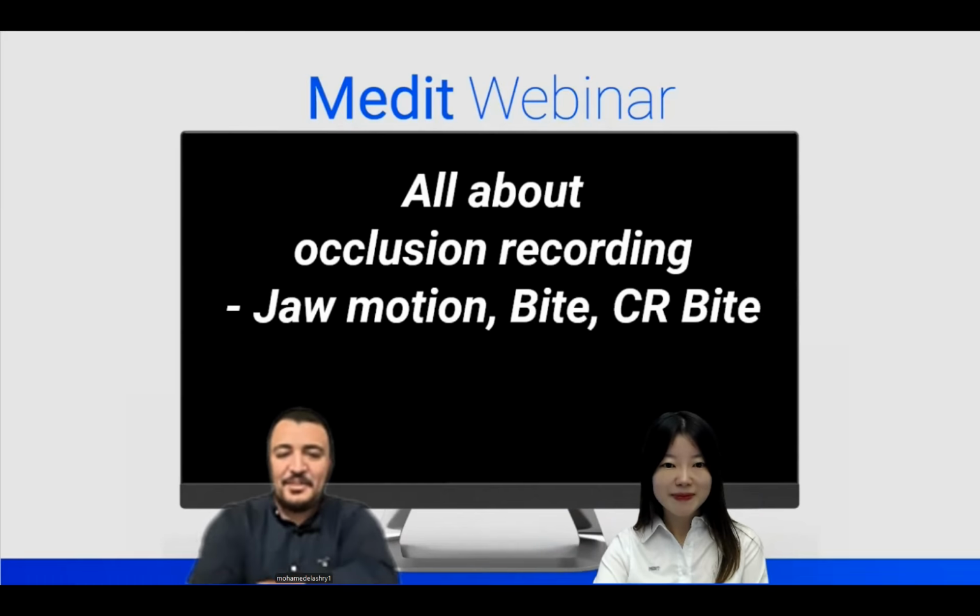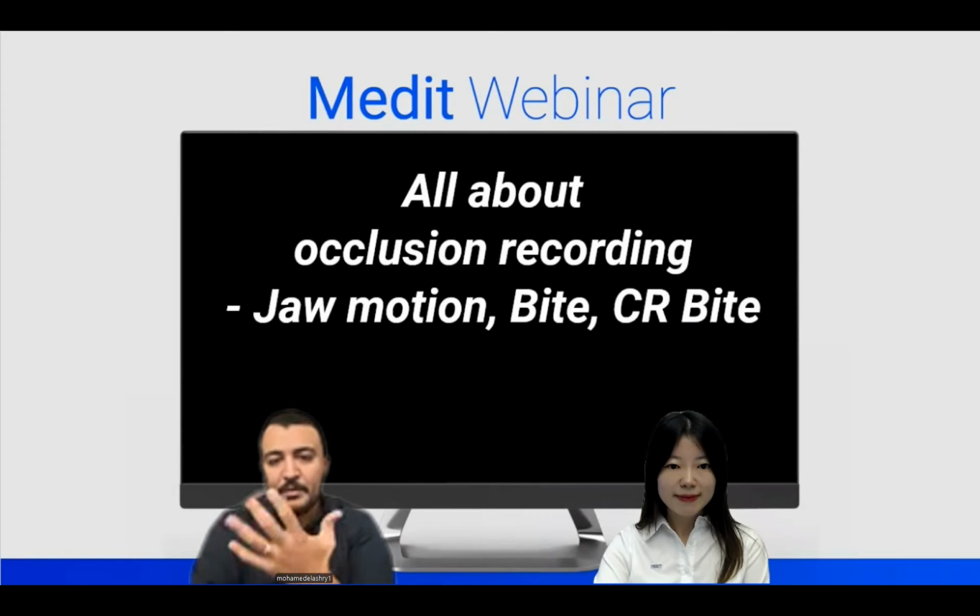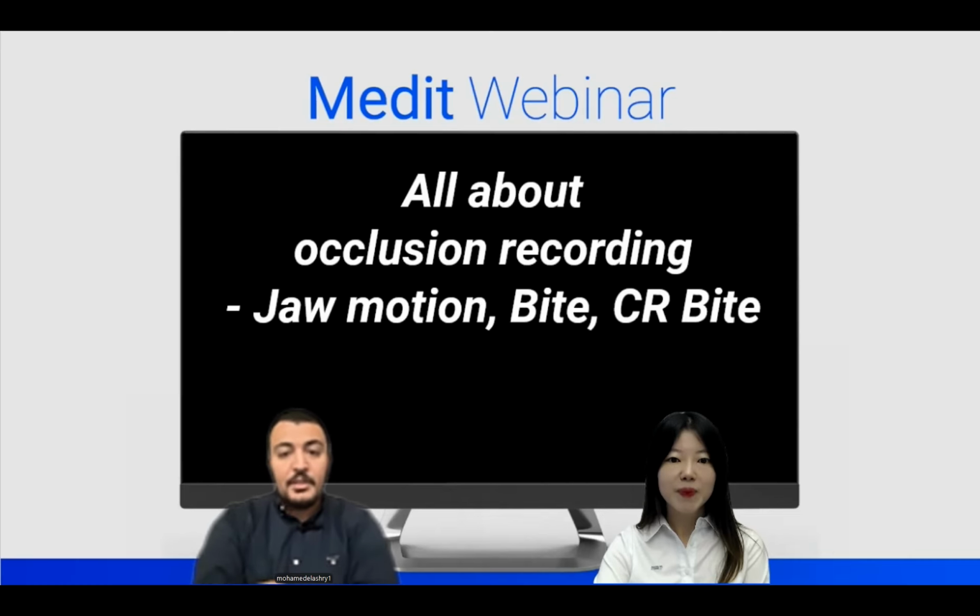Thank you very much for the invitation, Jenny, for this webinar. I think this is the third one together, discussing, if you remember, the five main concerns regarding digital dentistry and how to enhance precision. So I think today's topic is one of the most important and hugely underrated topics in the practice of prosthodontics, which is occlusion. So let's start. Okay, let's get started.